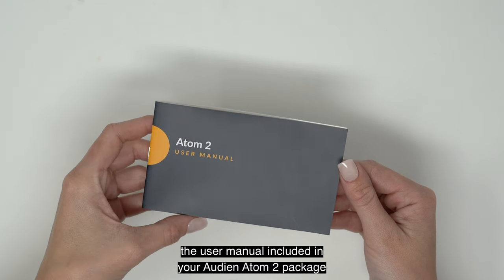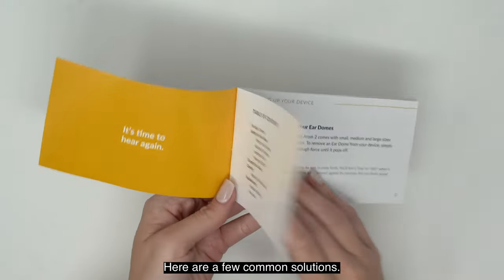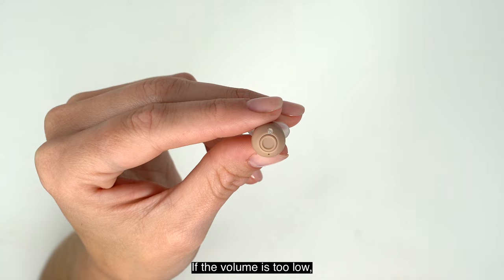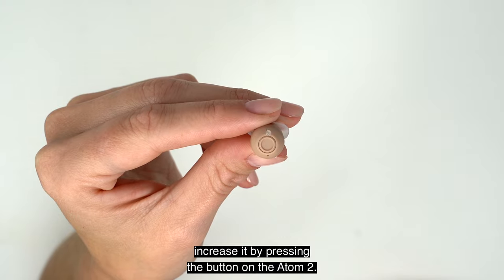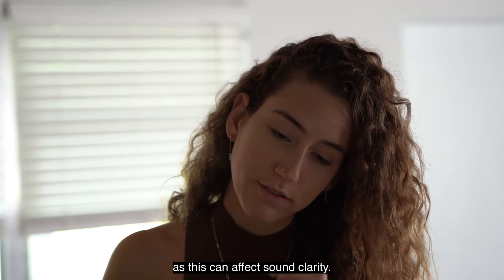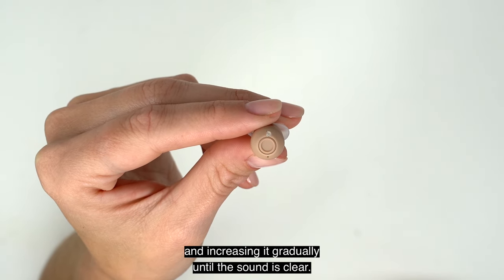If you run into any trouble with your device, the user manual included with your Audien Atom 2 package offers essential troubleshooting tips. If you're not hearing any sound, ensure the device is fully charged and debris-free. If the volume is too low, increase it by pressing the button on the Atom 2. Make sure the device is secure in your ear and your ear is not obstructing the microphone, as this can affect sound clarity. If the problem persists, try lowering the volume and increasing it gradually until the sound is clear.